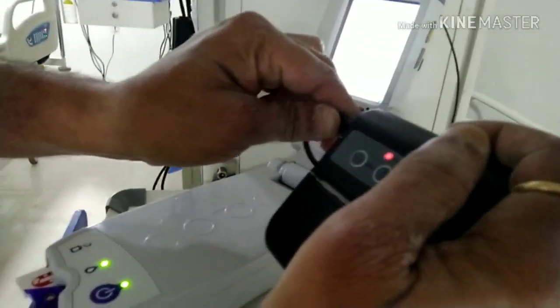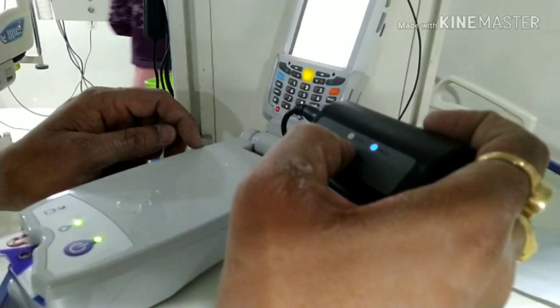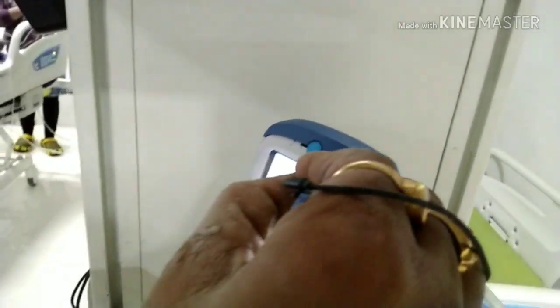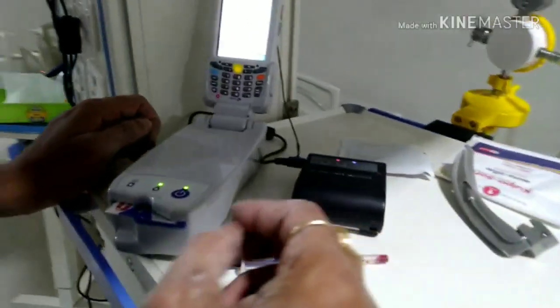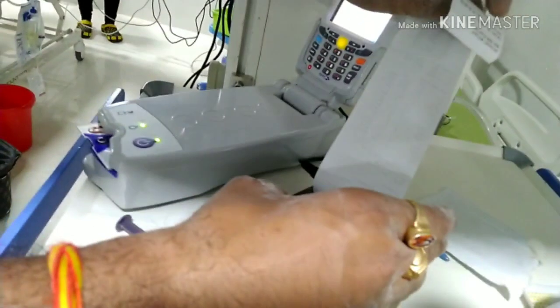Wait for the printing of the result. It will connect to the printer now. Print is ready — it's coming out with the result. Nice printing quality, very small and compact. And here is the result — now you can see.